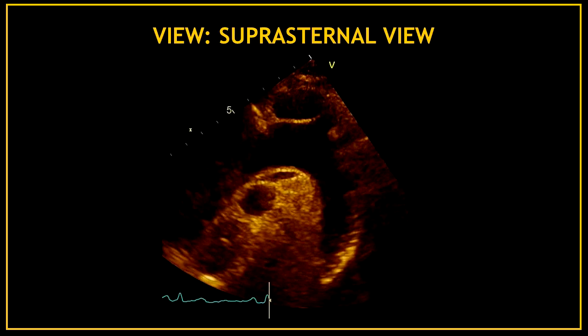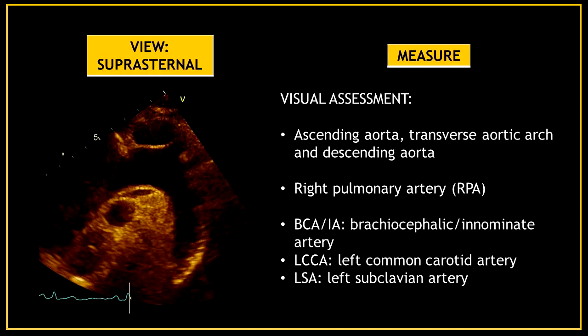This is the suprasternal view, also known as the suprasternal notch view. First, obtain the suprasternal view and perform a visual assessment of the ascending aorta, aortic arch, and descending aorta. In this view you can also visualize the right pulmonary artery, and don't forget to assess the brachiocephalic artery, the left common carotid artery, and the left subclavian artery.